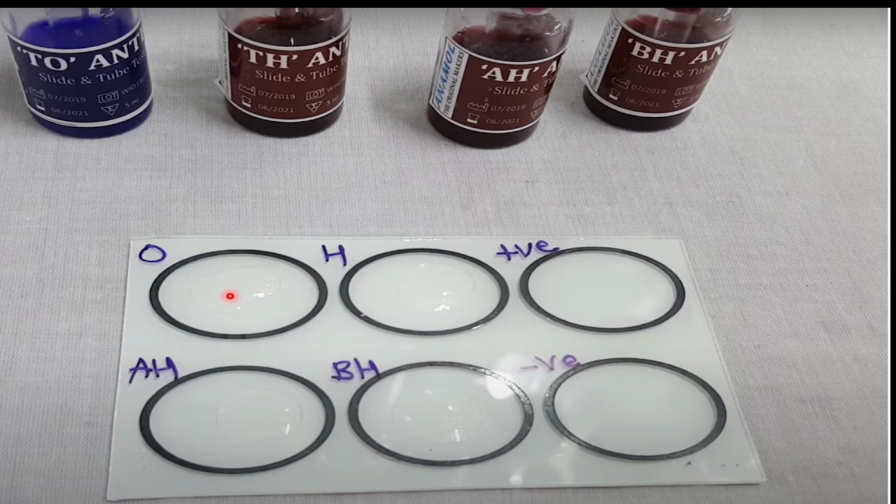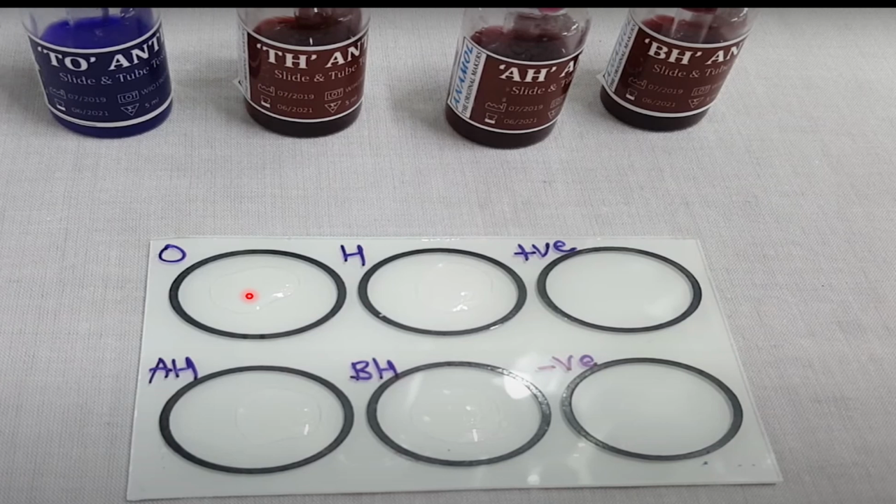Now, what will we do? What do we have? We have nothing. The patient has. No, we also have something, that is antigens. What does the patient have? Antibodies. Take out blood from his body. Remove the other parts of the blood and just take the serum.